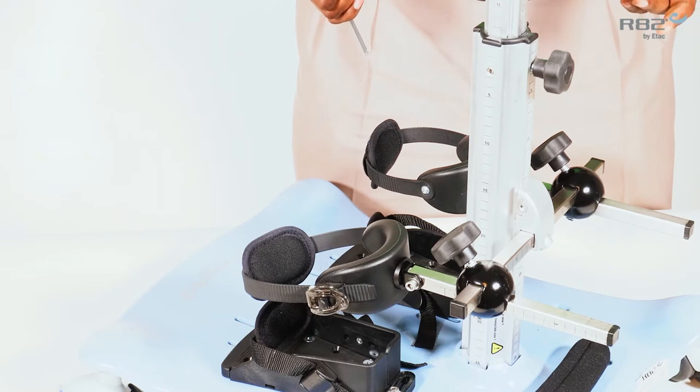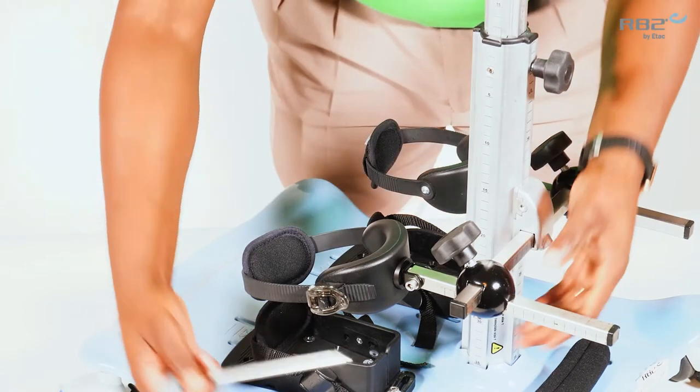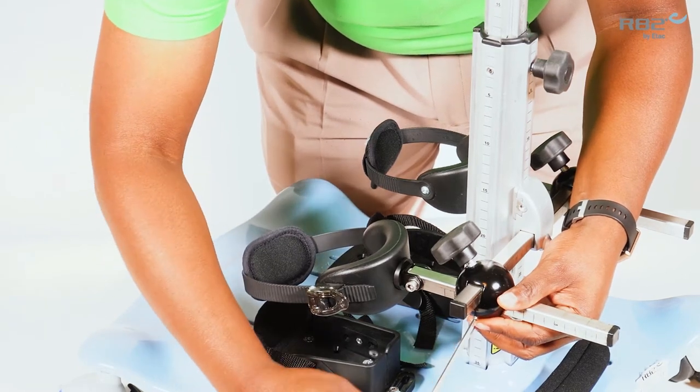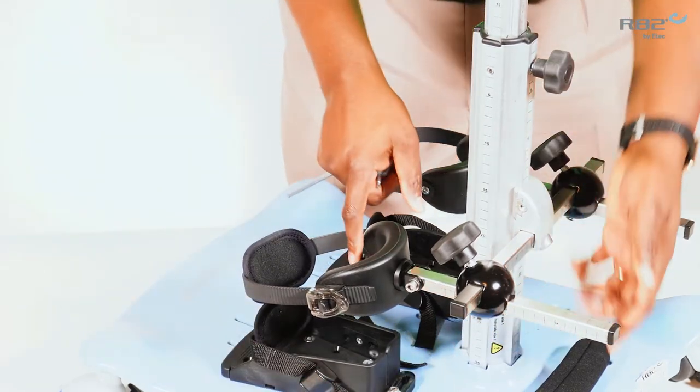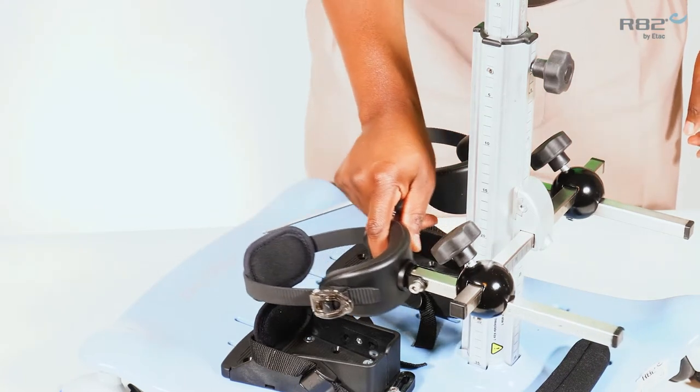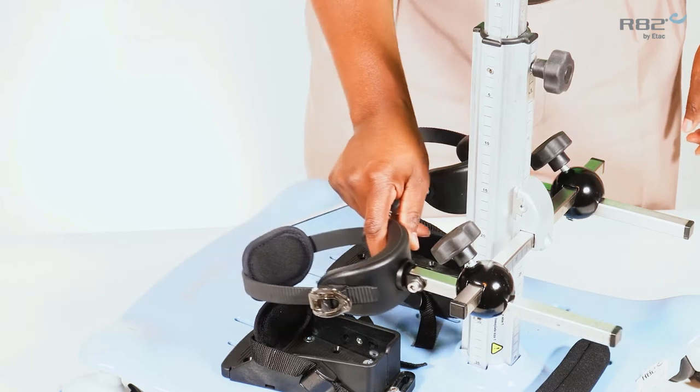The next is the depth adjustment. The depth adjustment is performed by the 5 mm screw located on the bottom of your mount. This will allow depth adjustment.